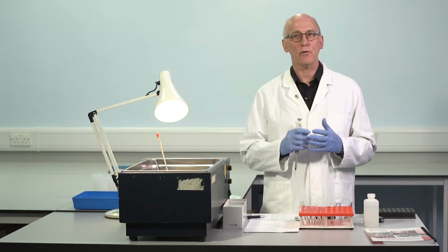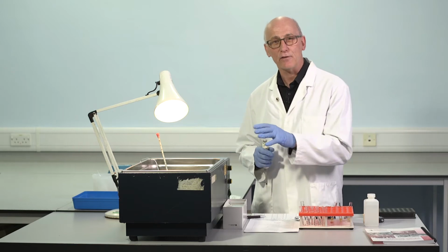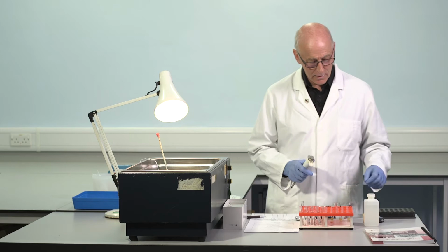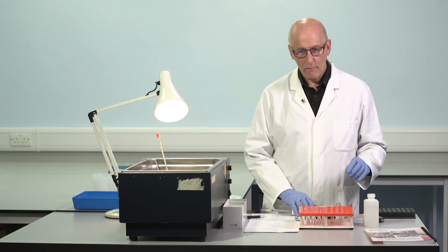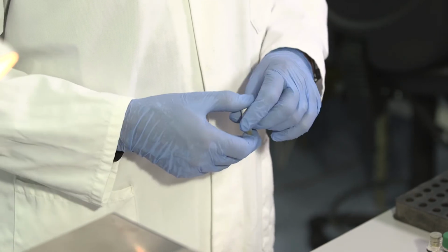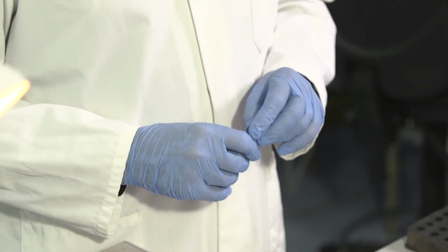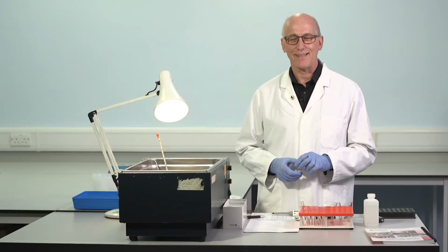It tells us we've reconstituted the reference material properly. It tells us that the reagents have behaved suitably. It tells us that there's been a successful assay. So it's really important to include an internal quality control. Very frequently, this is a freeze-dried material, a commercial material, and that's perfectly acceptable, and these work extremely well. It's also possible to prepare locally an internal quality control sample for factor VIII assays.